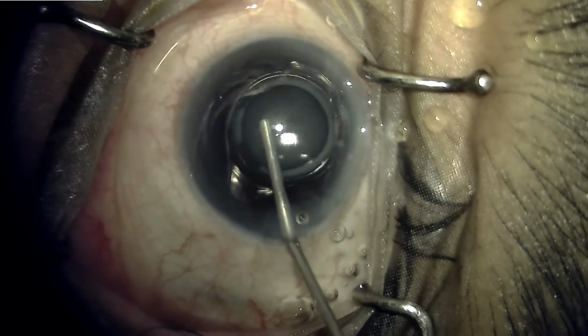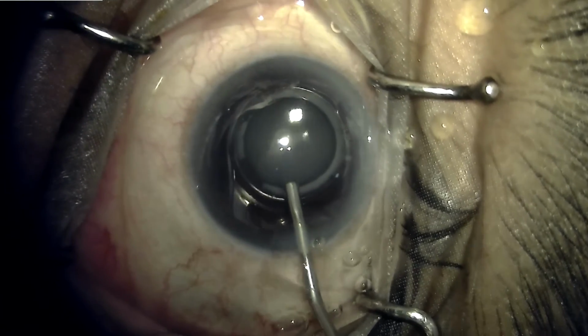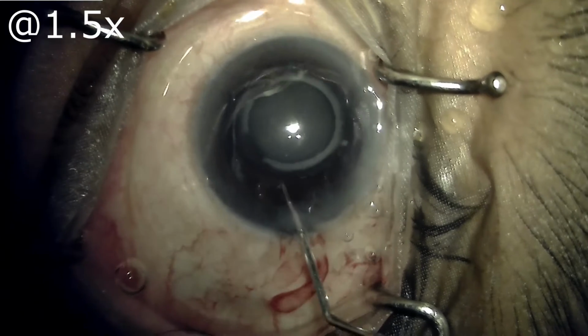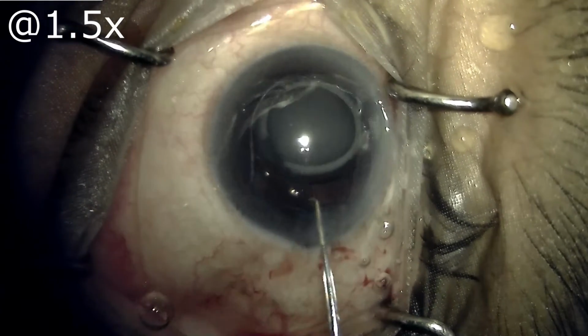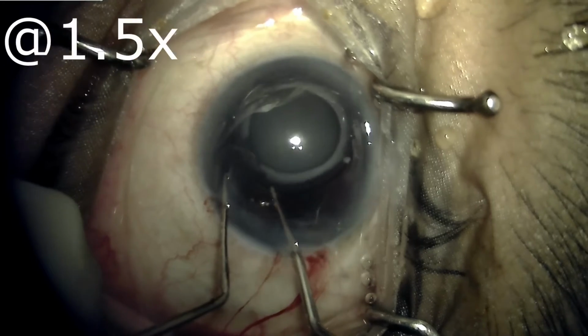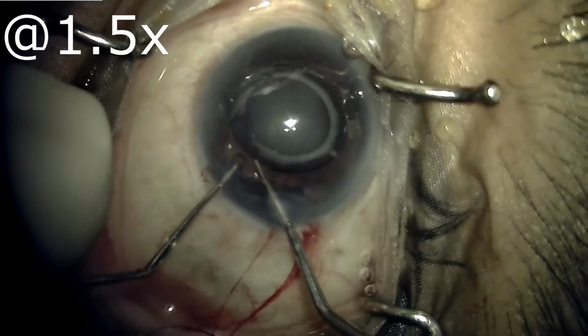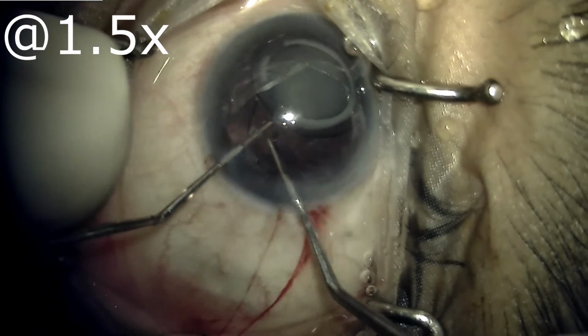The temporal approach was selected because the patient had against the rule astigmatism also, putting some viscoelastic behind the IOL to separate the posterior capsule. And I must tell you that YAG laser capsulotomy had been attempted to clear the PCO, and here we are trying to free the haptics from the capsular bag because it was stuck there.